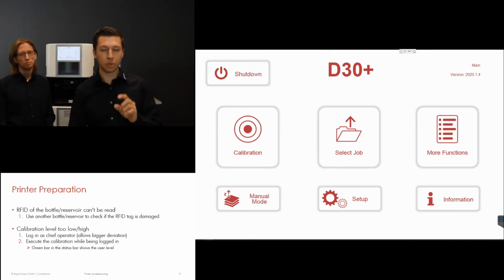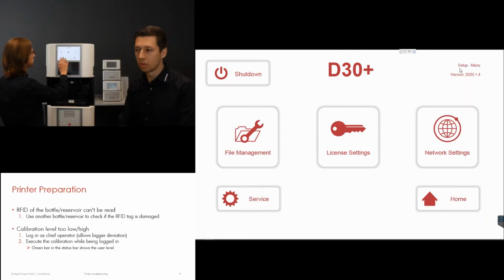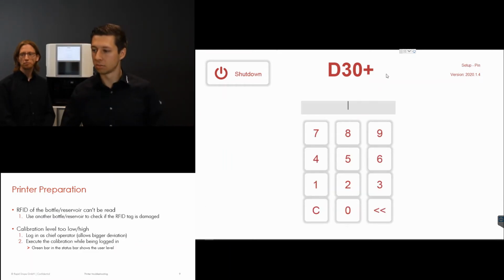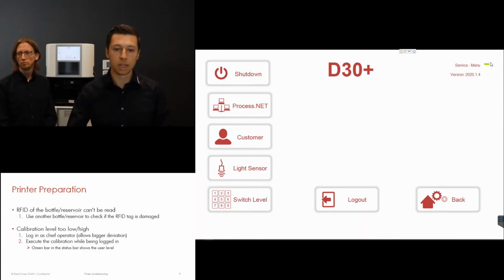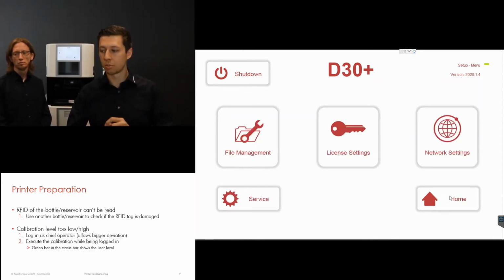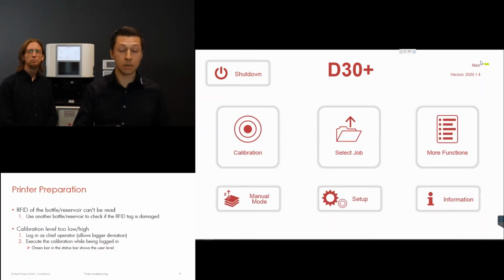Small hint, on the top right of the printer, so I can go with my mouse there, maybe you can see it then. Maybe we could do this real quick. It's going to be visible in the status bar with what level you logged in. We just log in as a chief operator, for example. And if you now have a close look at the top right section, we can see there is a green bar showing you logged in with the first level. If I just go back to the main menu, I'm still logged in, and I can now execute the calibration whilst being a chief operator.